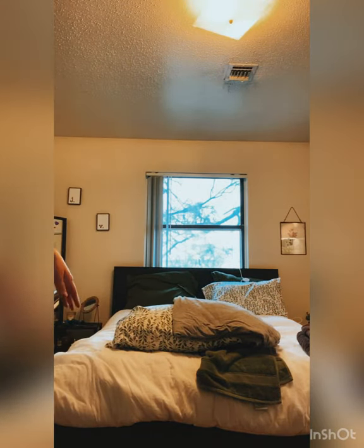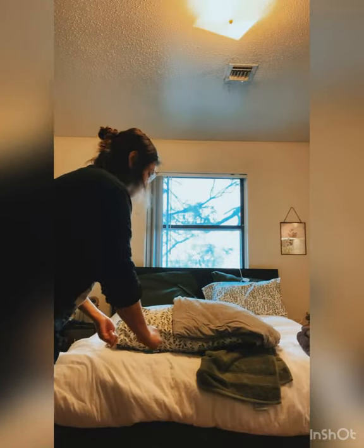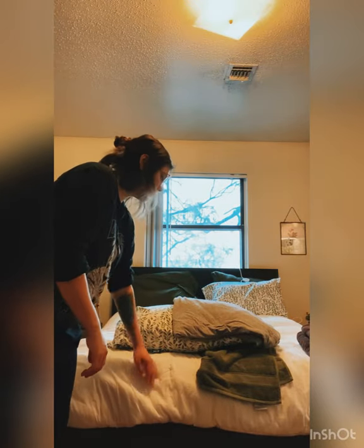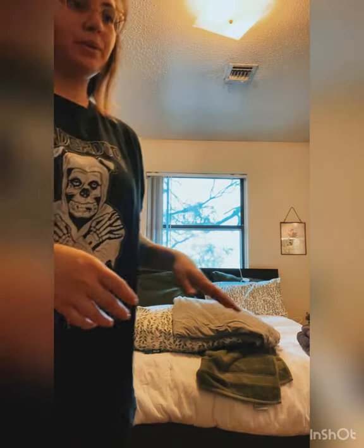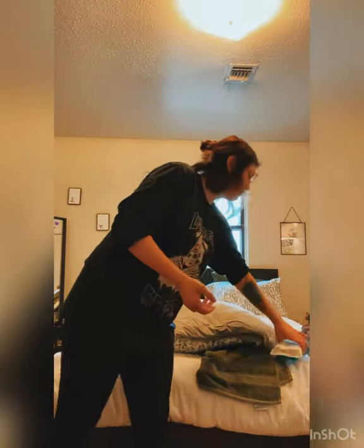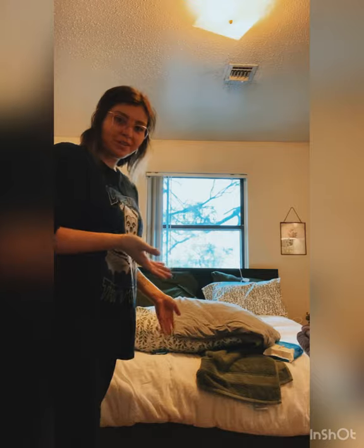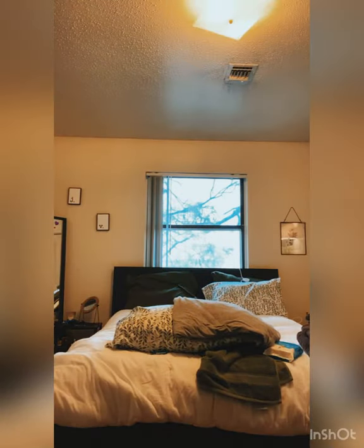I'm going to give my resident the call light. I'm going to raise this bed rail and lower the bed. I'm going to make sure my resident has toilet paper or wipes. Then I'm going to perform hand hygiene and let my resident know to use the call light if they need me. Then I'm going to leave the room and shut the door.